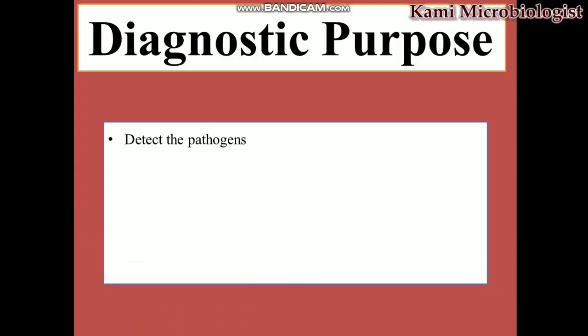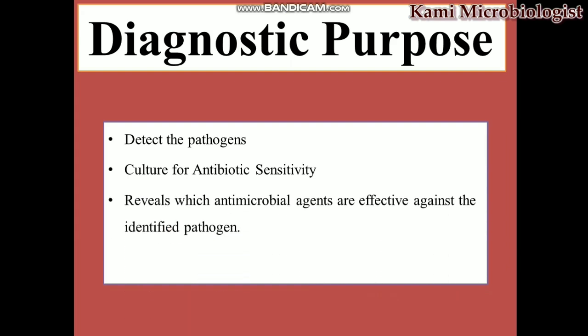The diagnostic purpose of this test is to detect the pathogen. Culture for antibiotic sensitivity reveals which antibiotic agents are effective against the identified pathogen. It also helps to monitor the treatment response.